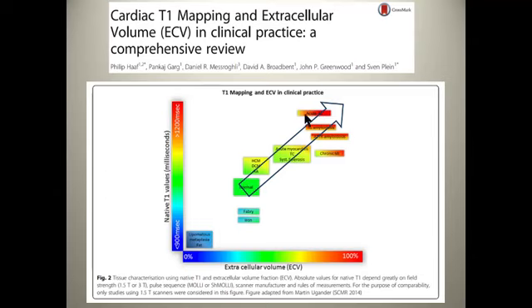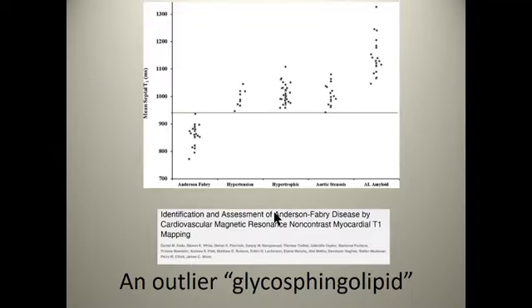Obviously, there's some interesting stuff in terms of acute MI and chronic MI. So this may be related to cell rupture or cell swelling. I'm not quite sure. And then you've got some outliers. So fat's different. It's just a different molecule, so it's obviously not going to play the game. And then Fabry's disease and iron are different. So I'll just talk about those briefly.